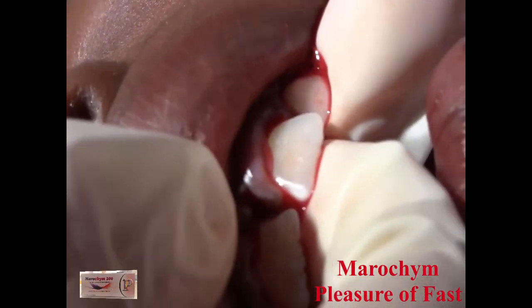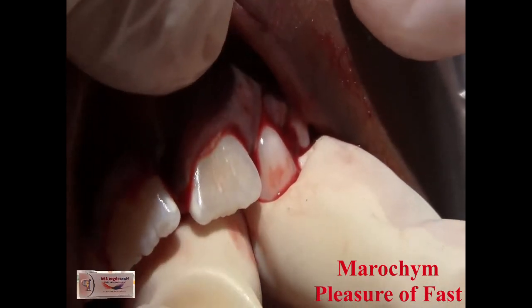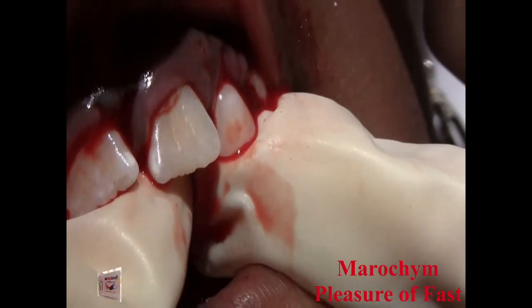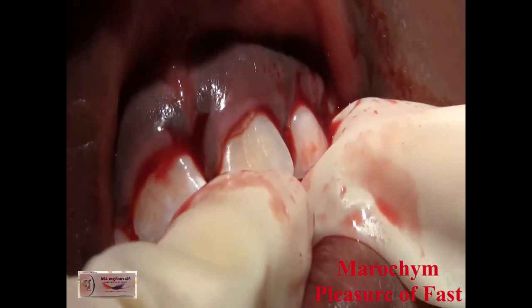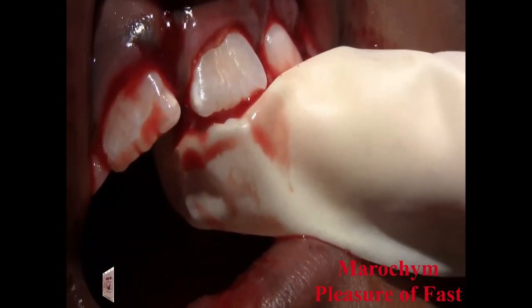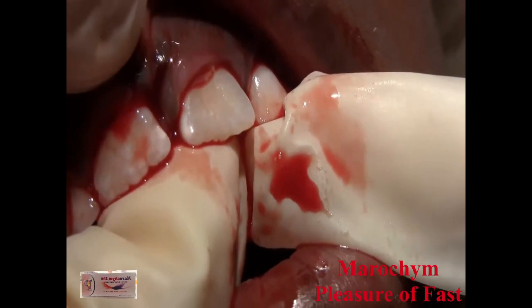So good. I'm just putting your teeth, I got you. I'm just fixing them back where they were. Matt, can you see? Sure can. I'm trying to see if we can get them back into position. We want to try to push that whole segment. You're doing so good. Oh, I'm so proud of you. That's pretty close.